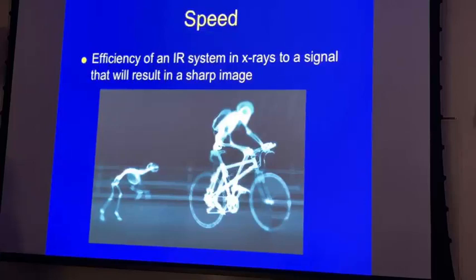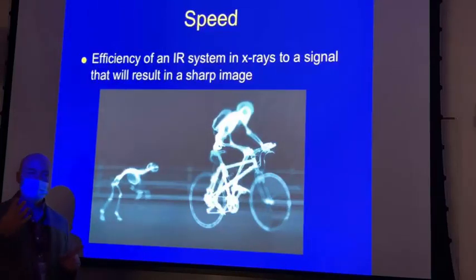So what we had in most cases was what they called high speed, which is 400 speed. So you have 100 speed up to 400 speed. 400 speed is 4 times as fast as 100 speed. So since 400 speed is 4 times as fast, that means you could use 1/4 of the radiation to create the same image, right?